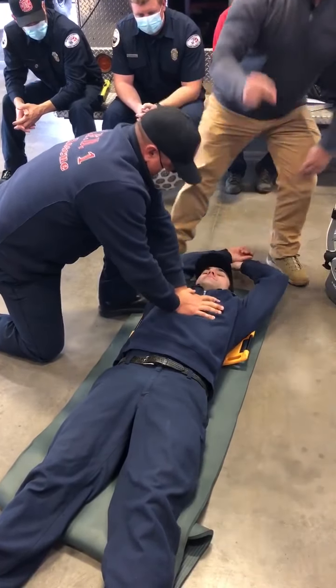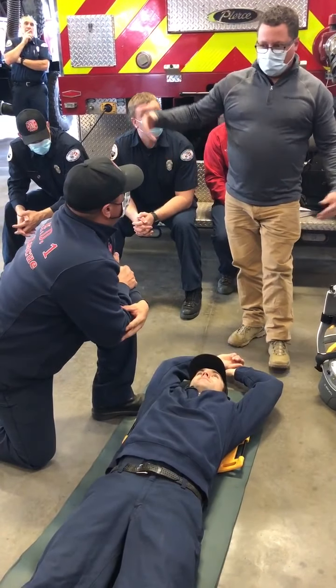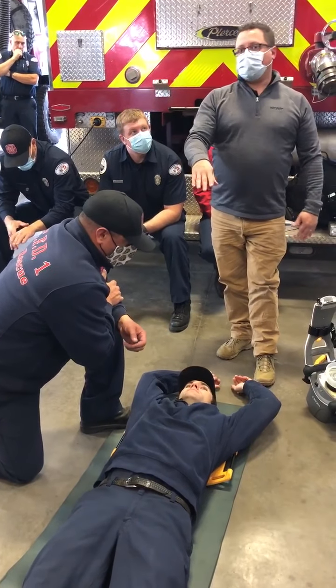5, 4, 3, 2, 1, 1000, 2, 1000, 3, 1000. Count it down every time. You get caught on a piece of safety equipment, you get caught on the ground, I don't care what, somebody came out with a gun, I don't care what happened. Stop what you're doing. Go back on the chest.